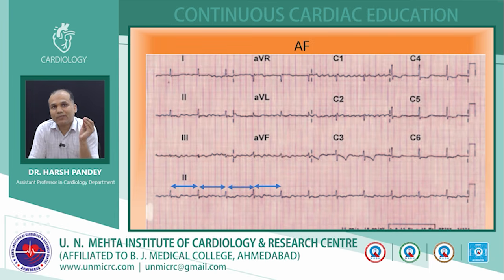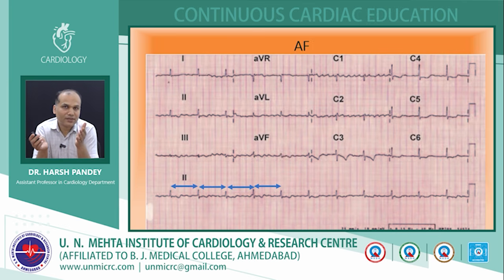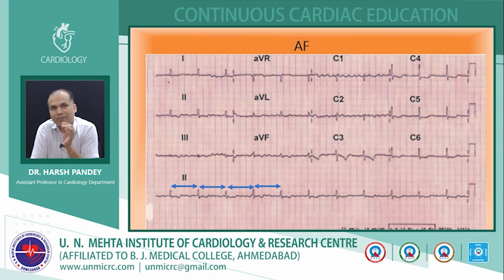Because in case of atrial fibrillation, there will be irregularity in the fibrillatory waves, so there should be irregularity in the QRS complex also. But if the patient develops complete heart block, AV nodal block, the irregularity of those fibrillatory waves is not transmitted to the ventricle, and the RR will become regular because of the junctional escape, or sometimes it becomes wider also if it is an infra-AV nodal level of block. But RR will become regular if the patient is having AF with complete heart block.